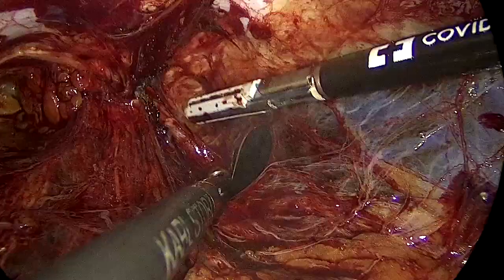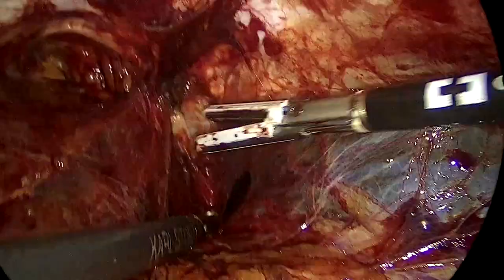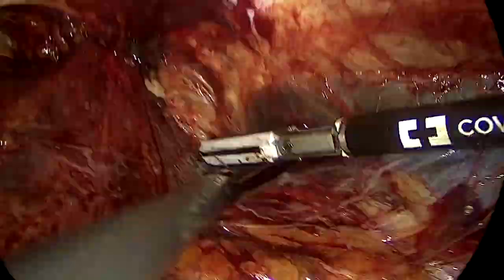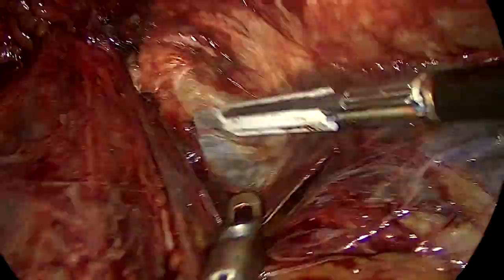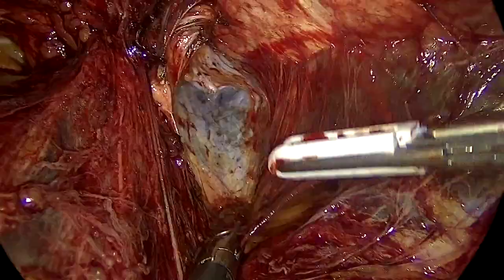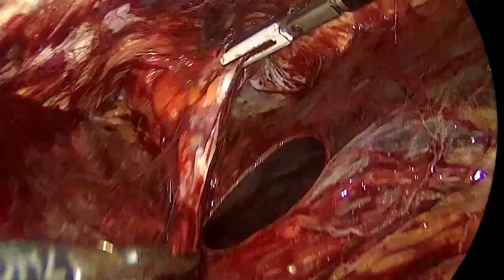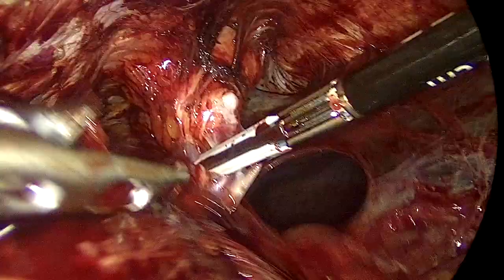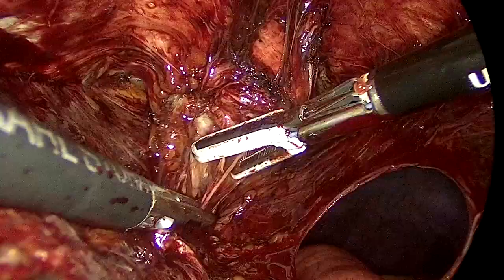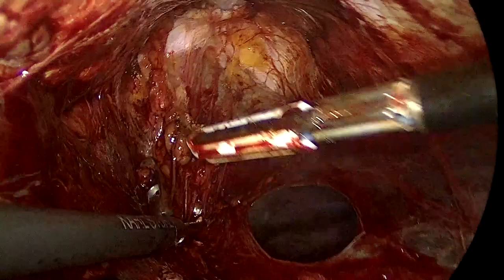Here you see me doing the transition from zone 1 to zone 2, which goes from the median umbilical ligament to being on top of the falciform ligament. I go around the hernia defect, and once I've done this, I create my volcano sign, then reduce the hernia sac and the contents of the hernia — in this case just a little bit of fat.